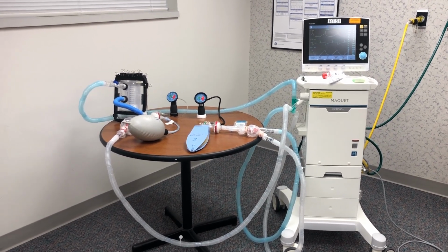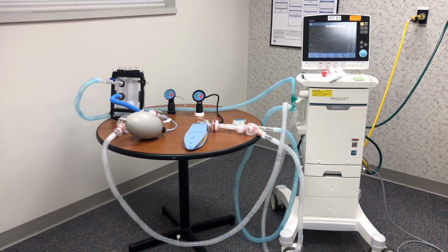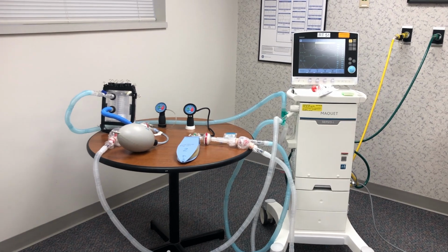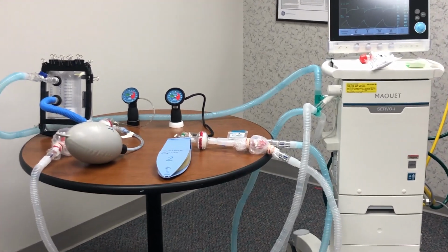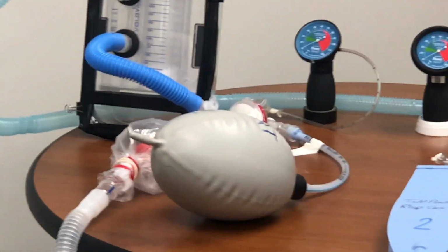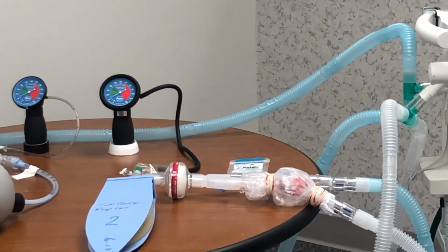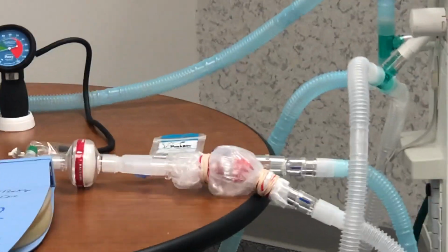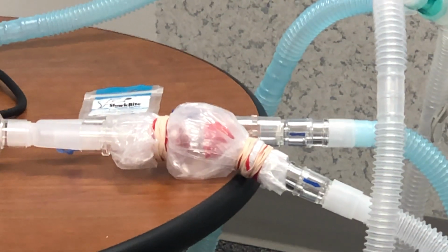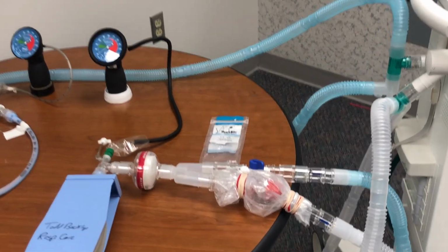So as we all know, as intensivists and RTs, it is very easy to connect multiple patients on ventilator, but the key thing is how do you control the individual parameter. And the way I have achieved that is the blue tube basically goes to the patient, which is, of course, the inspiratory limb, and for simplicity's sake, we'll start with this patient number 2 here. The blue tubing is connected to a one-way valve, and I'll come into detail why this one-way valve is there, which is again connected to the valve which I just described.